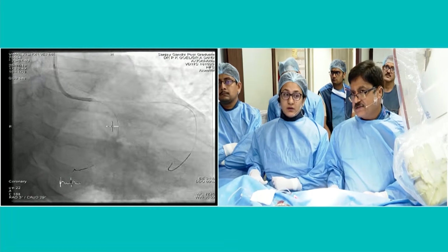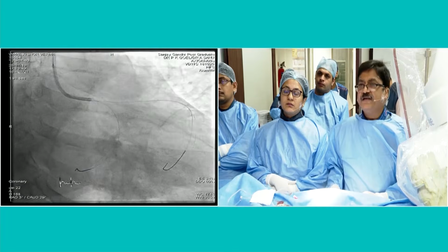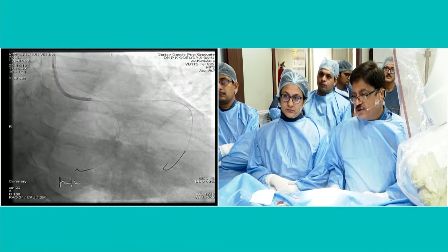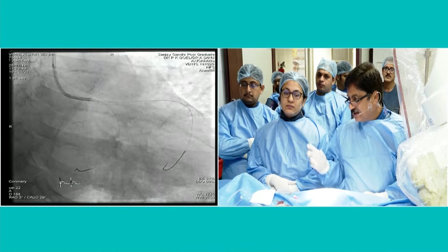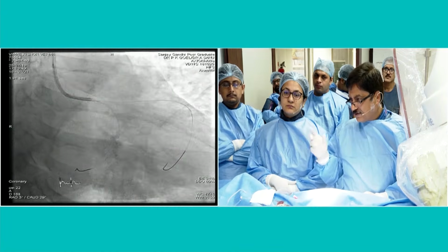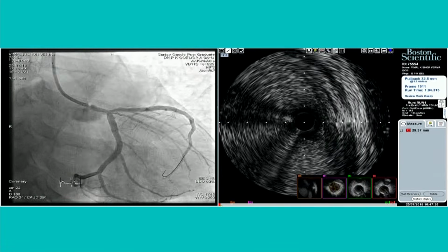Left main, and I strongly believe that left main intervention should not be done without imaging. In fact, there is that Korean study from Park, one of the studies where only IVUS versus no IVUS, and he's shown a reasonably big difference of about 8% difference in MACE, if I'm not wrong. And I'm pretty convinced about it.